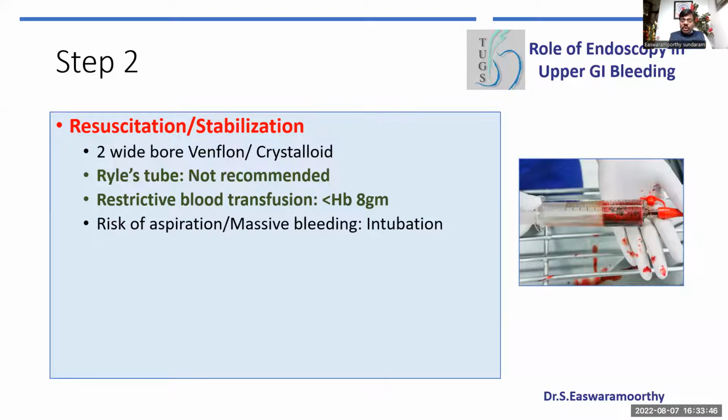It is more like a museum piece to me. Thanks to pharmacotherapy like terlipressin and efficient management with plasma, we get the patient onto the table for endotherapy fairly soon. So we don't rely on the Sengstaken-Blakemore tube, which, if not used sensibly, can be more lethal than doing any good to the patient.